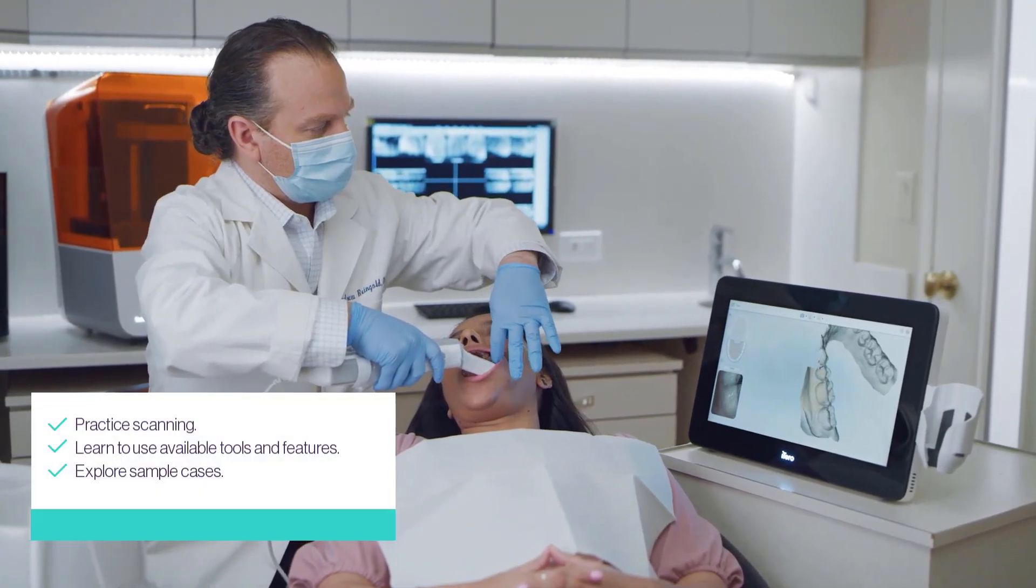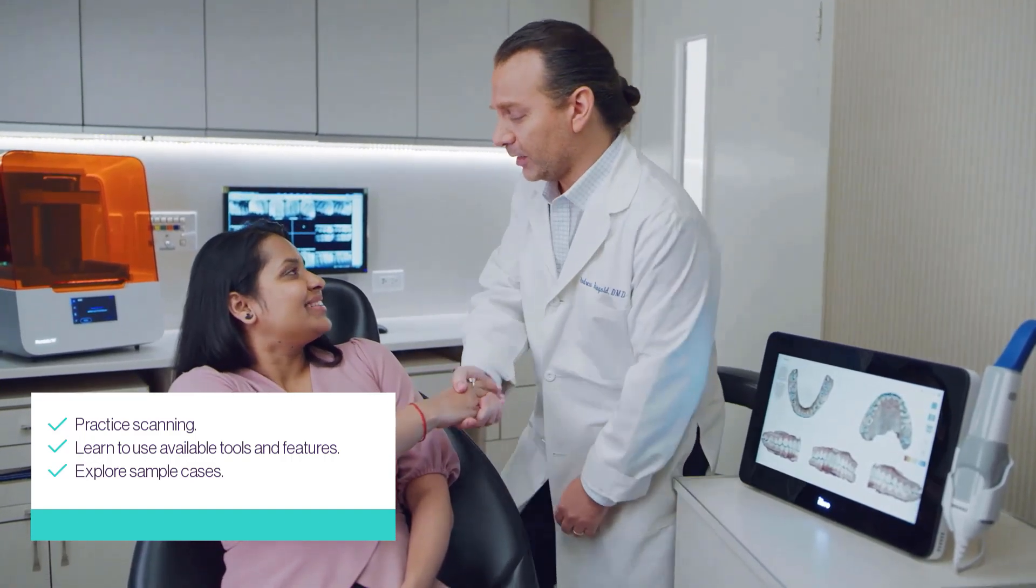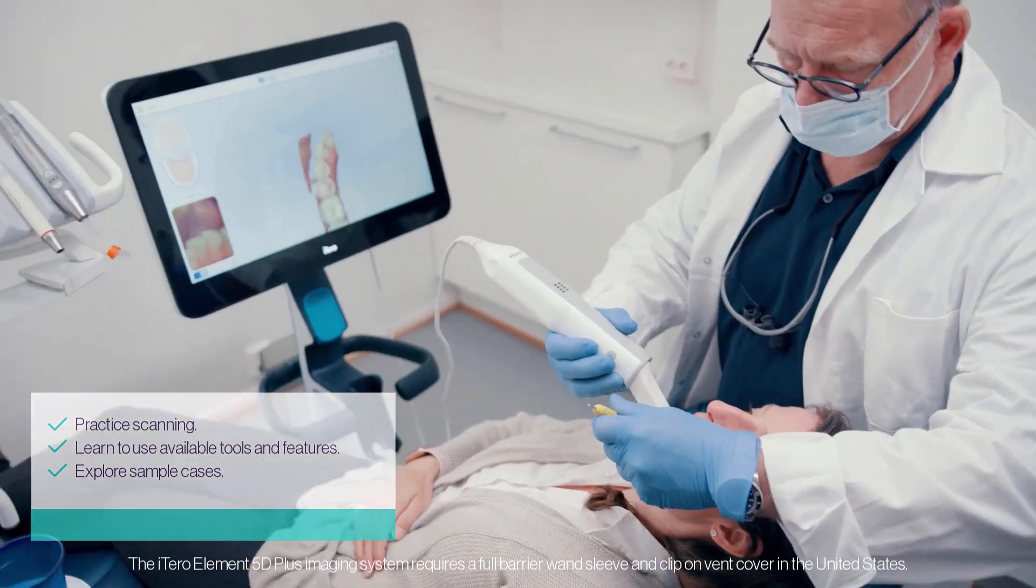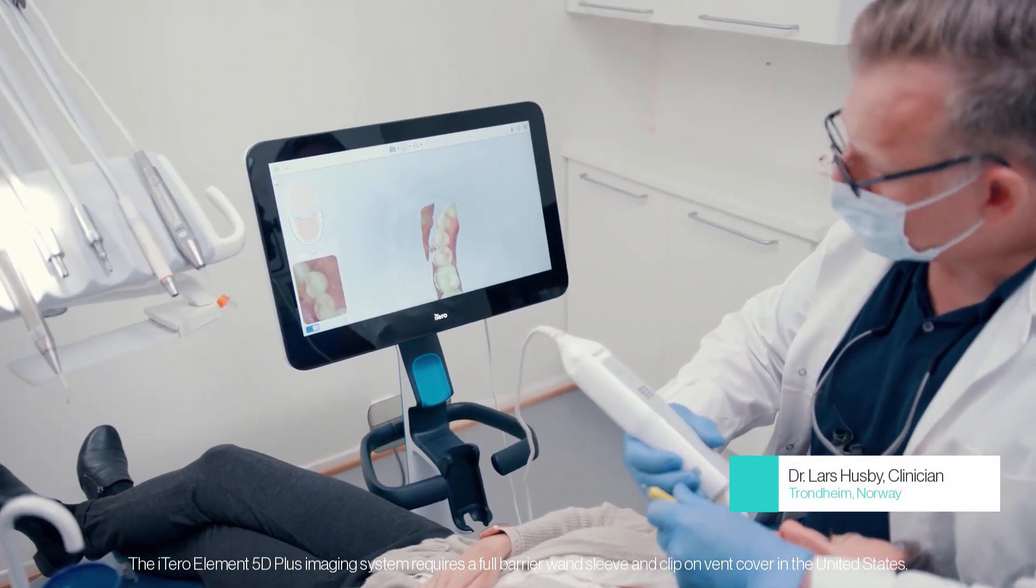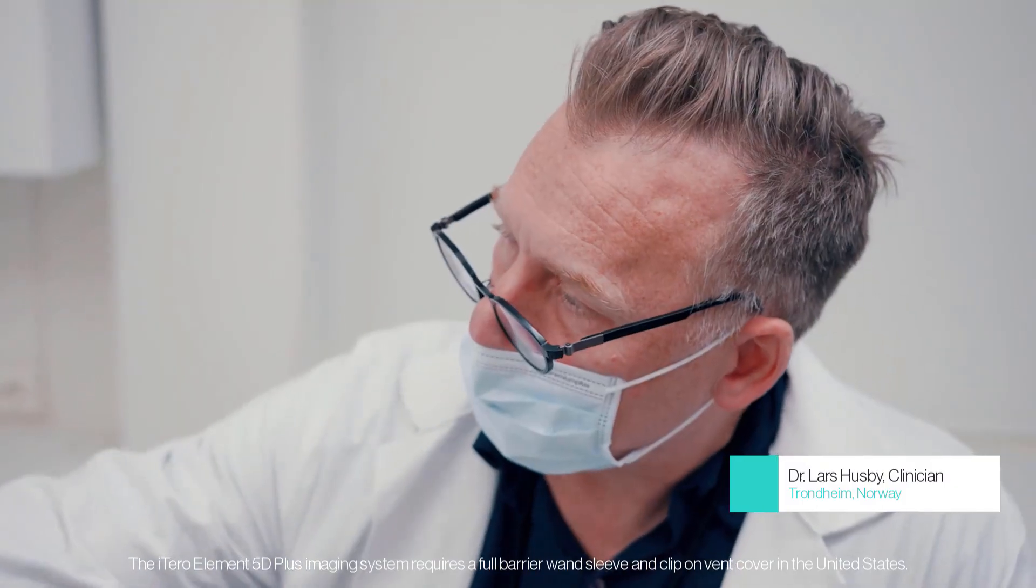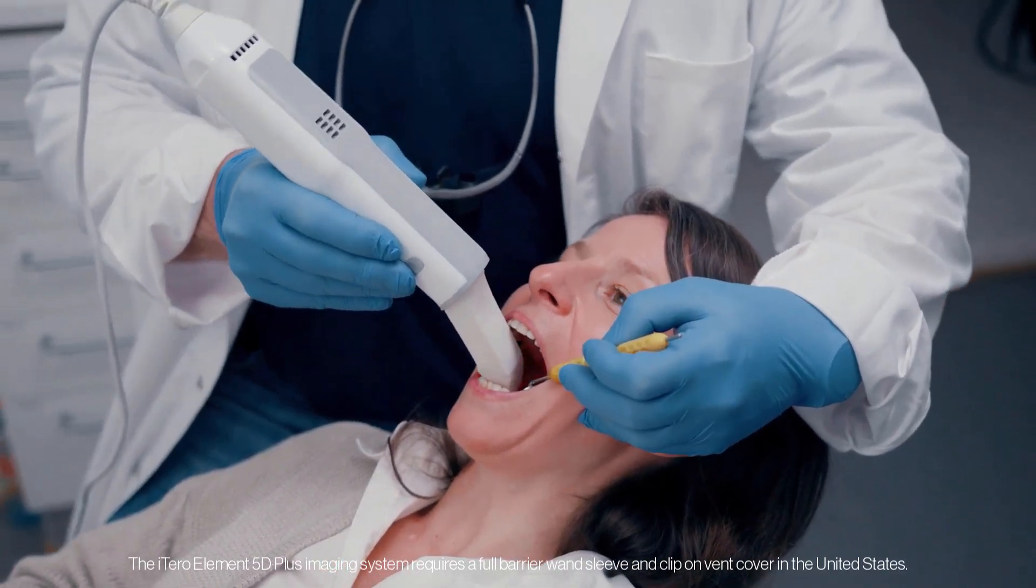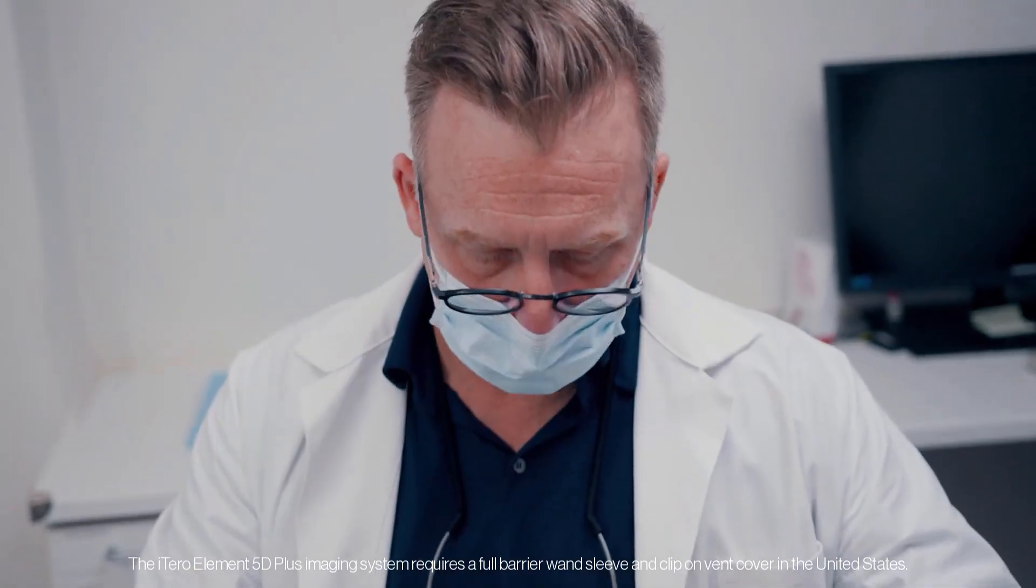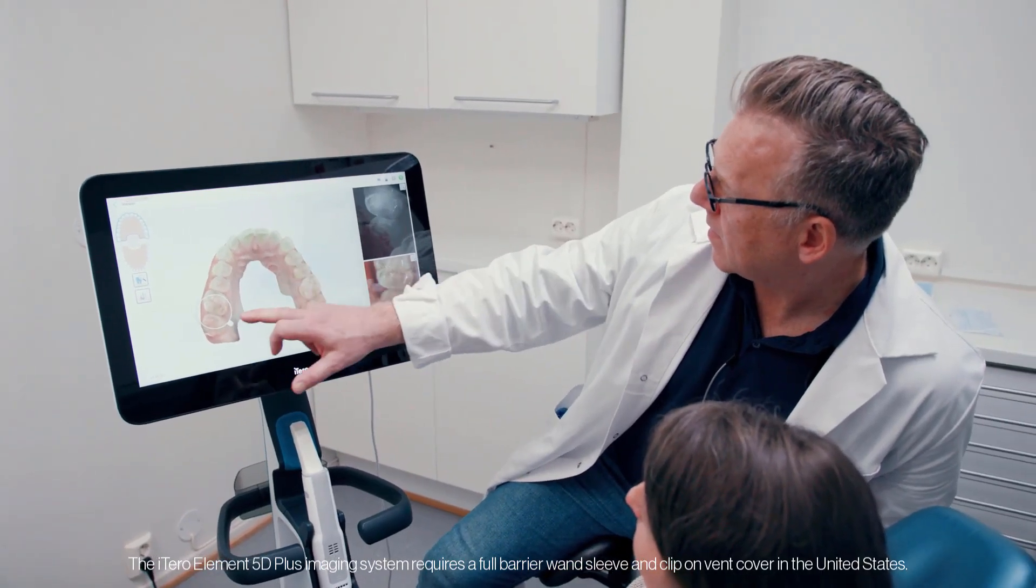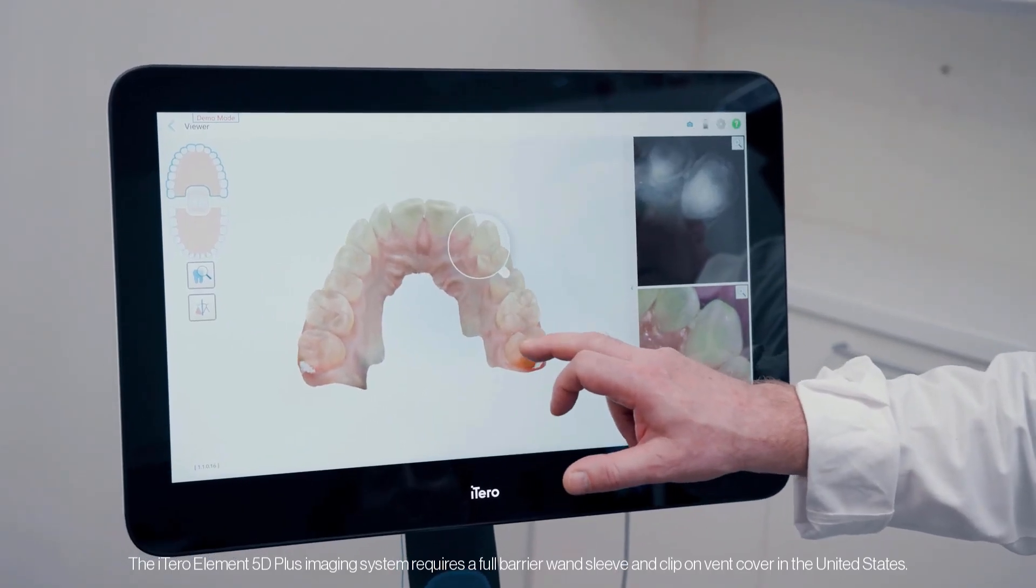This mode allows users to practice scanning and safely explore various software tools and features available during the scanning process. Additionally, demo mode includes a wide range of sample cases demonstrating clinical Invisalign and restorative cases. The iTero Element 5D imaging systems include cases featuring the review tool and iTero NIRI near-infrared imaging technology.